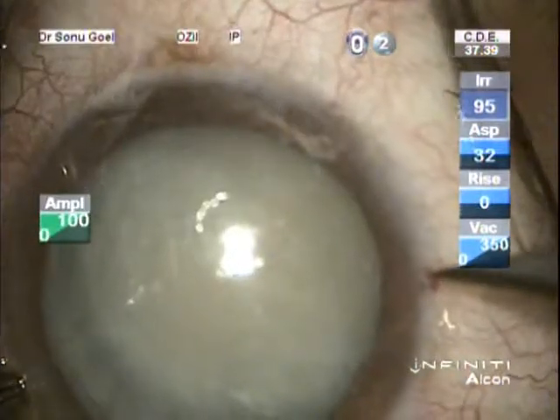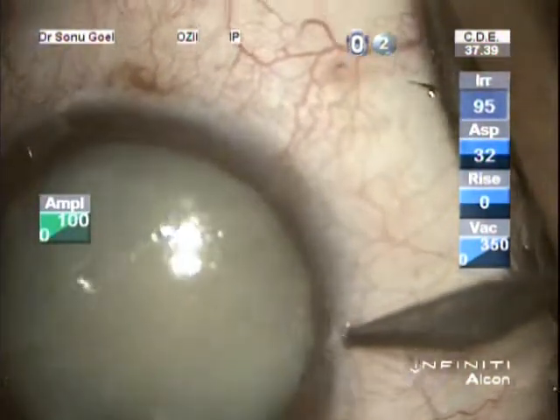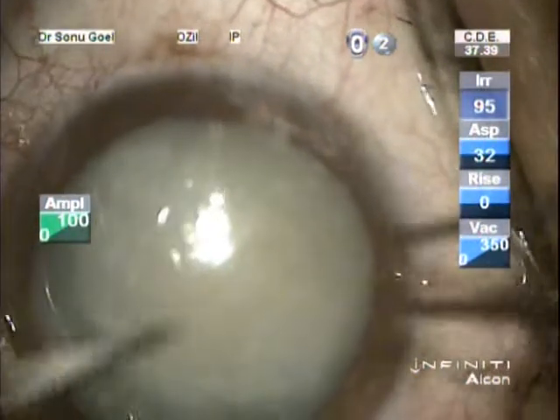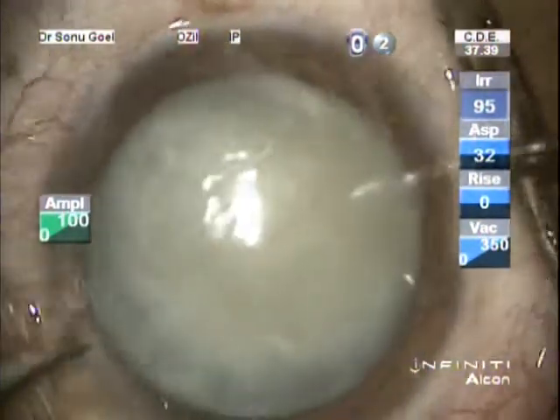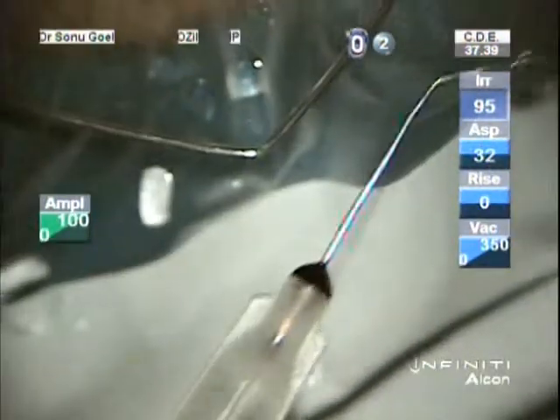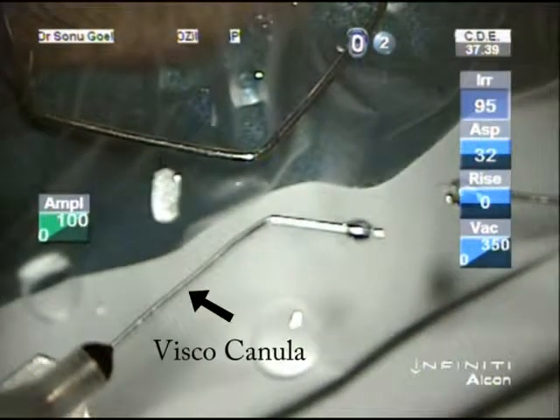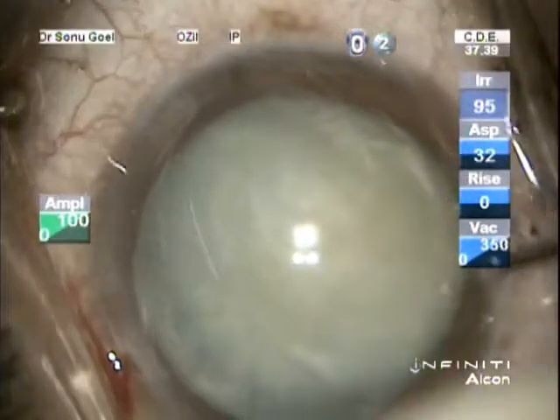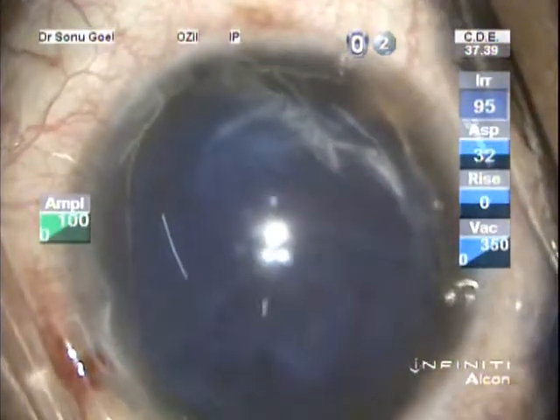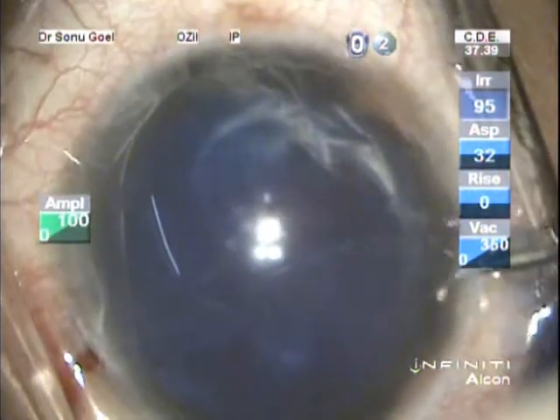As we see here in this video, this is a white cataract. We make two side port entries, one at the 12 o'clock, the other at the 6 o'clock. Note is made that this is under topical anesthesia. This is the viscoelastic cannula and this is the cystiotome. From one side port we will use the visco cannula, and from the other side port we would introduce the rhexis forceps. So trypan blue is used to stain the white capsule.